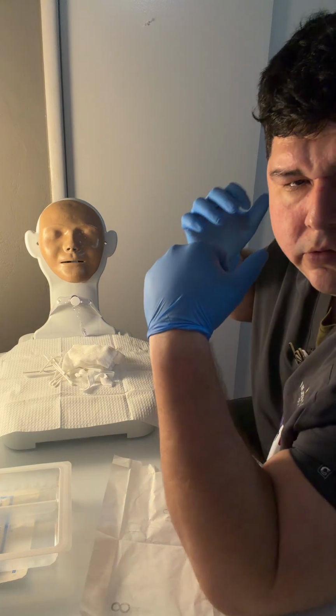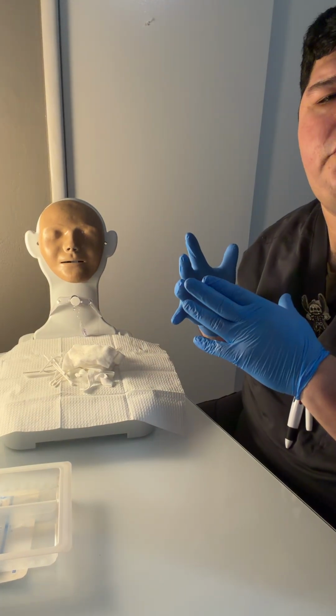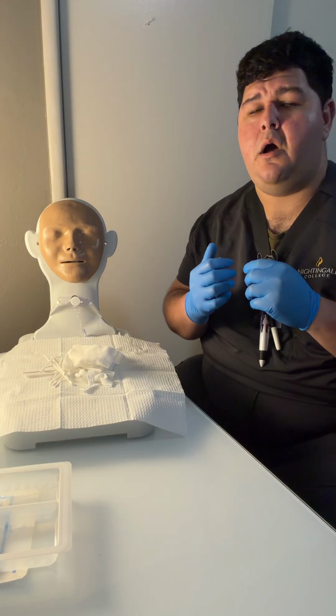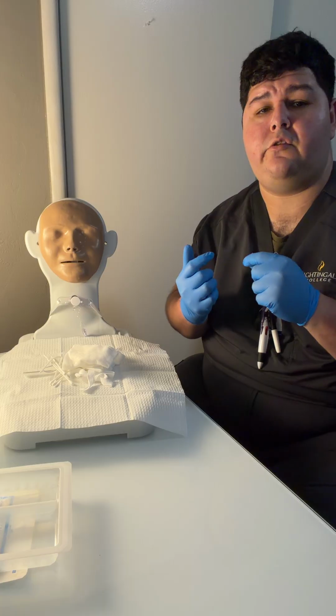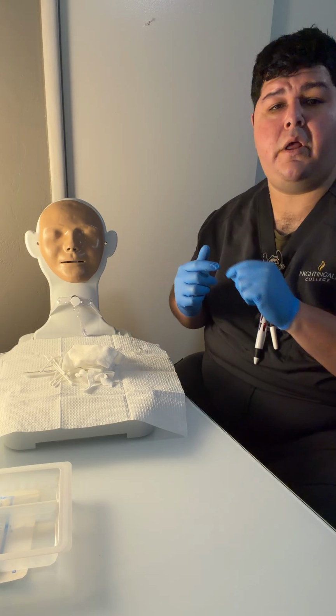Okay, discard my paper. Ideally, I would ask for another nurse or a nursing assistant if they could come and help with the procedure. I would task them with stabilizing the trach so it doesn't fall off or become dislodged. We want to go ahead and organize our tray.